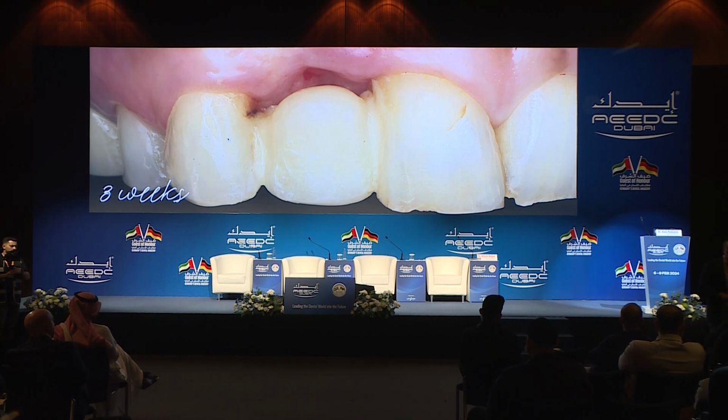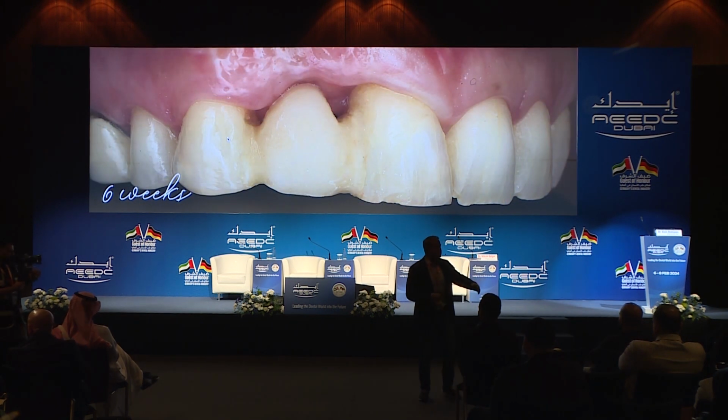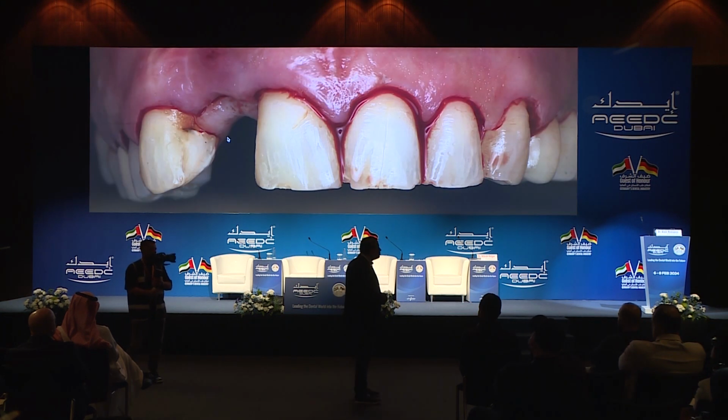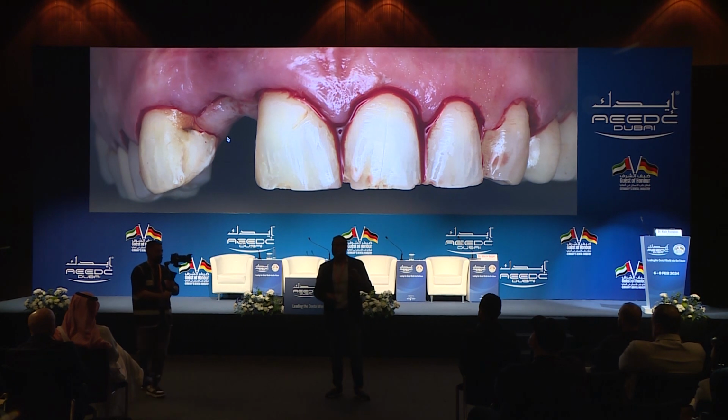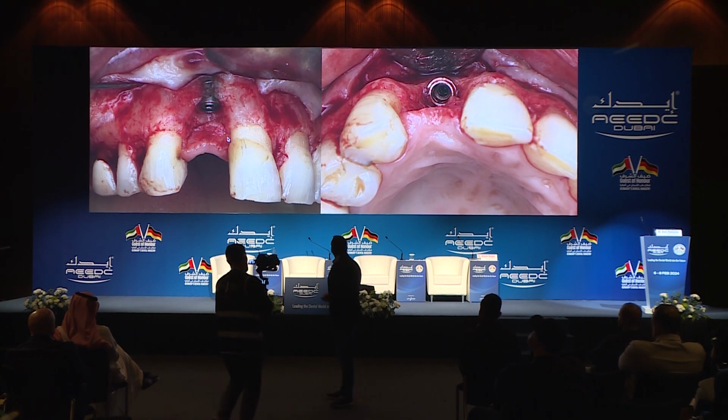So just by removing the bad crown and the bad temporary and letting things heal, this will come down, and it did come down. And Giorgio here, the prosthodontist, was helping me guide the tissue with the temporary. So we always add and remove the temporary just to bring the tissue down. Now I have a good condition to do my graft. I have good quality soft tissue, and at this point it's a more predictable procedure to do the connective tissue graft. And this is what we did. So we removed, look at the implant.